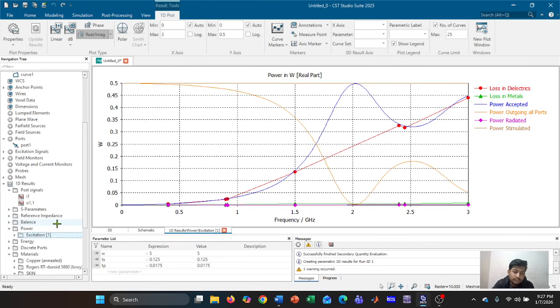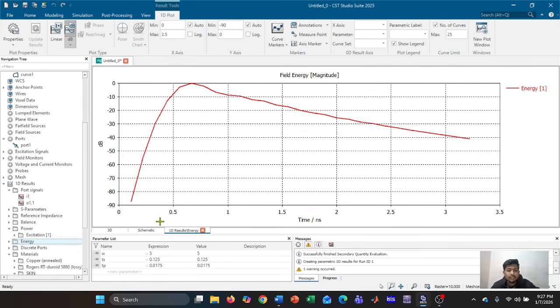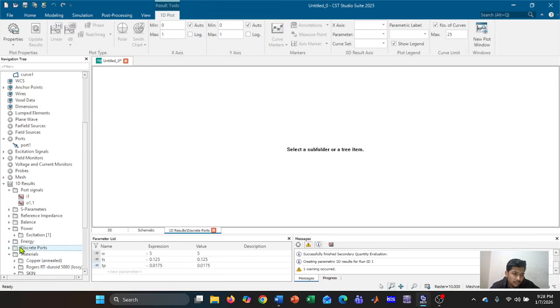So now you can see the field energy. This graph shows how energy builds up and then disappears. You can see initially, at around 0.6 or 0.7 nanoseconds, the energy rises quickly, then it smoothly goes down. It means no energy is trapped, which is safer for the human body. Okay, next let's see our port connections.